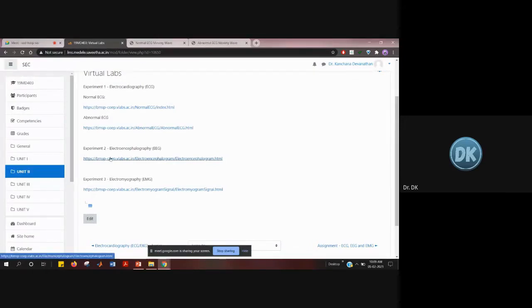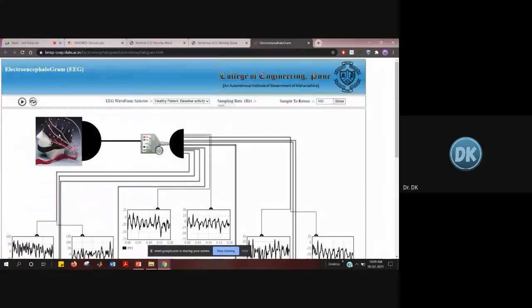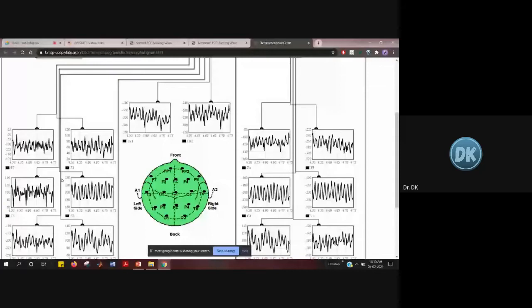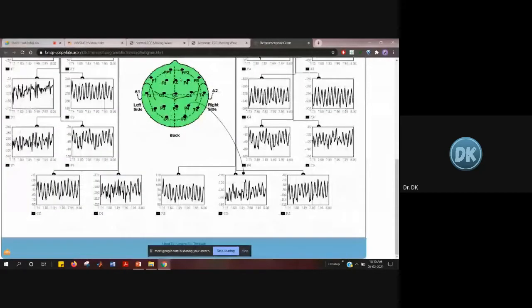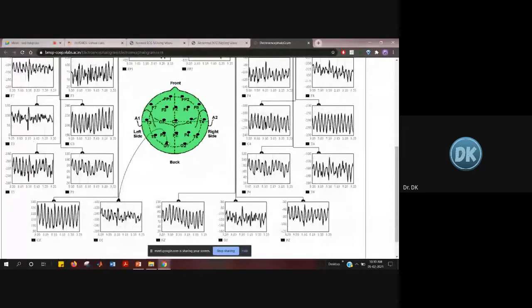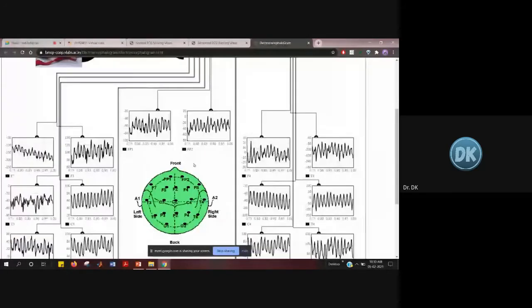Electroencephalography records the electrical activity of the brain. This shows the head and how you place electrodes on the brain. There is a cap with multiple electrodes — the person wears this electrode cap. If you click the play button, the waveform for each electrode is displayed. The center figure in green shows which location the signal is being taken from, and each box corresponds to a specific electrode's signal. Clicking on each electrode shows its corresponding waveform.